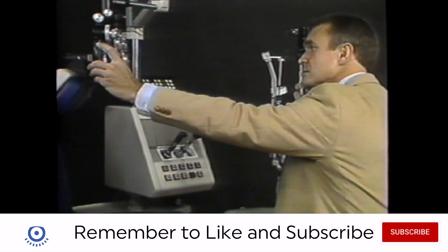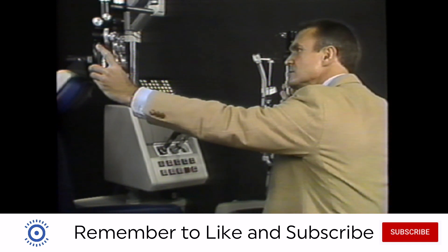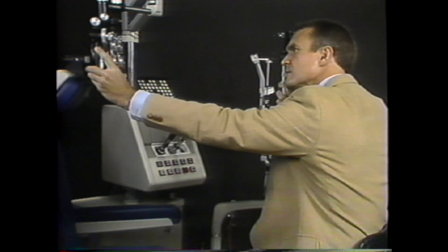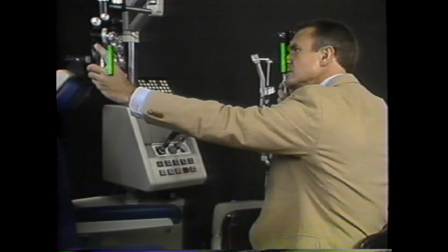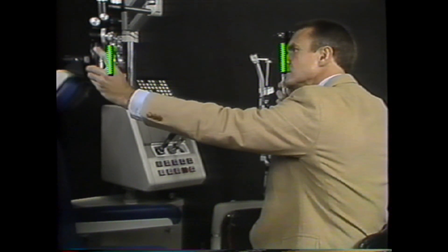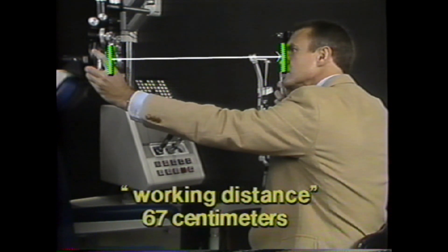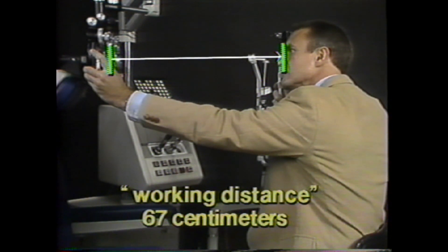To proceed with retinoscopy, you should sit a comfortable arm's length away, holding the retinoscope in one hand and sitting as far away as possible while still being able to adjust the controls on the phoropter. The distance between the phoropter and the retinoscope is called the working distance and is usually about two-thirds of a meter, or 67 centimeters.